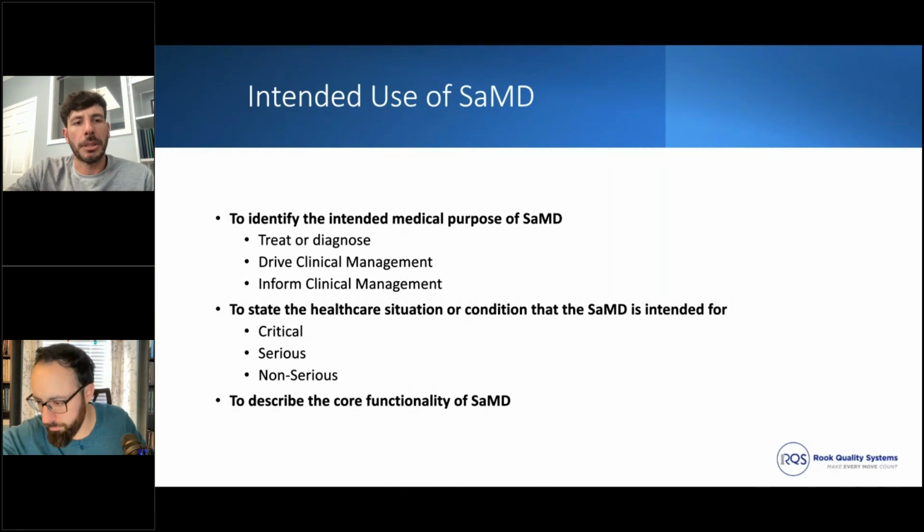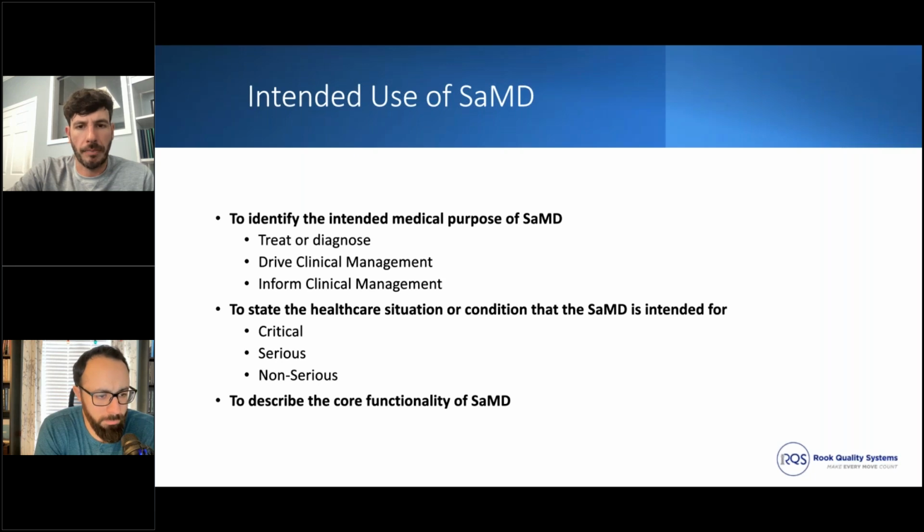So it can be used to treat or diagnose, drive clinical management, or inform clinical management, and then there are different categories within this as far as critical, serious, and non-serious. So we want to identify where our software device falls within these categories and then go from there.